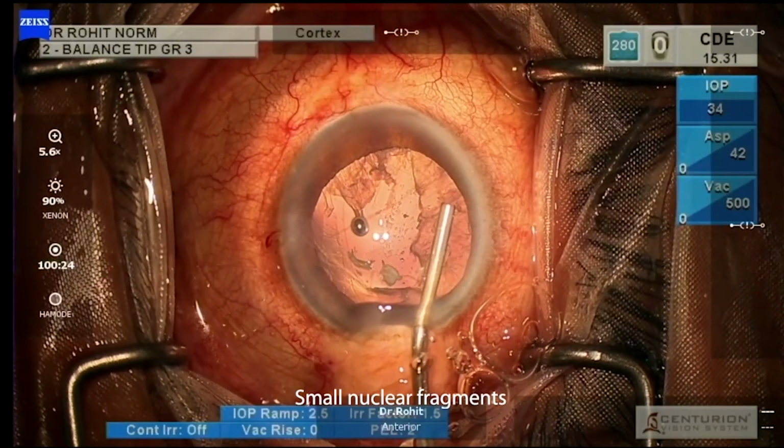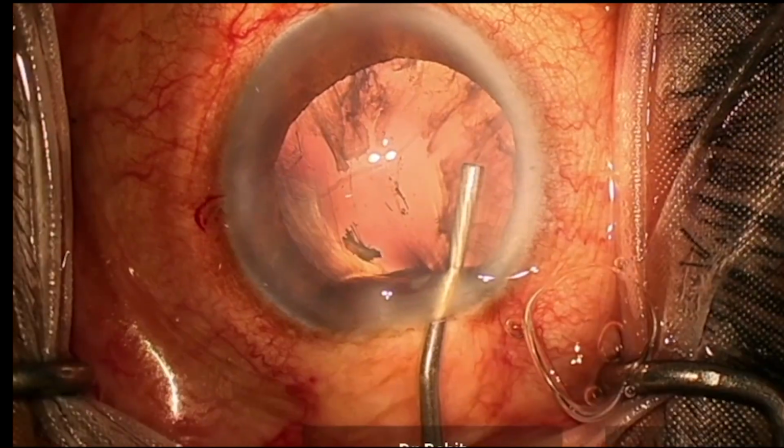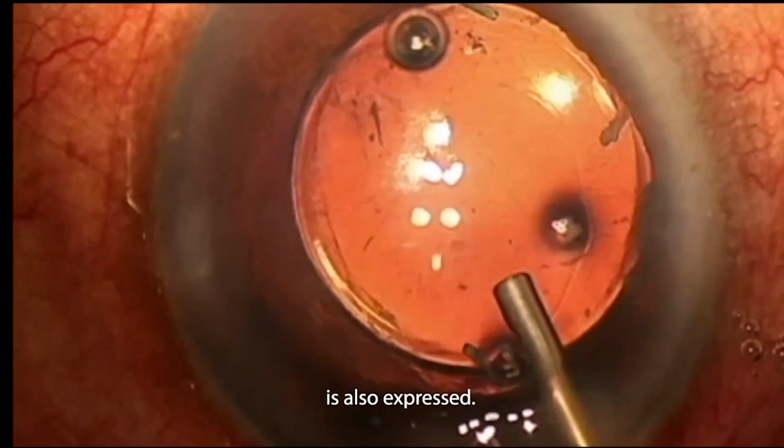Small nuclear fragment is successfully expressed with the AHF remaining intact. Now, the second small fragment is also expressed.